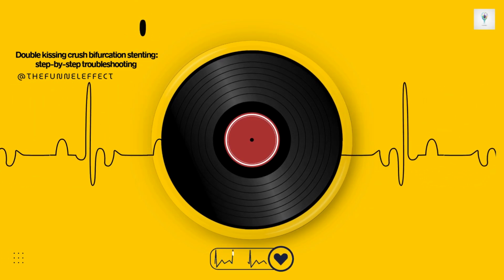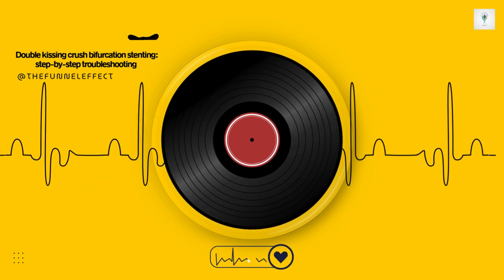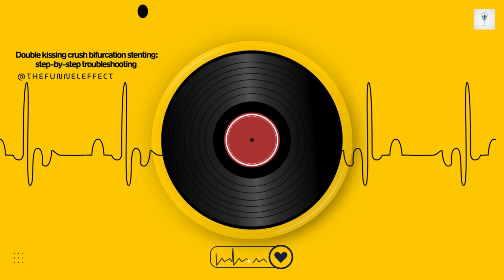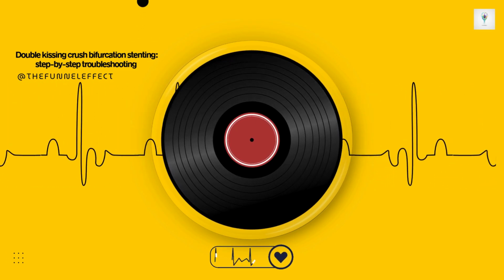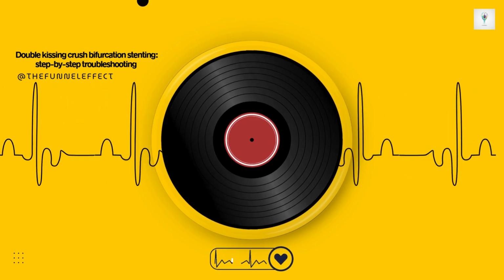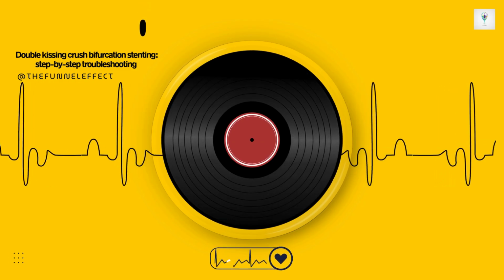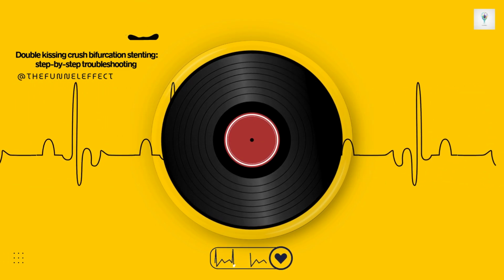If the stent just won't go, do you consider drilling then? You think about it very carefully. If it's a large side branch, heavily calcified, maybe in the left main, and the angle isn't too sharp, then yes, atherectomy might be necessary up front or even as a bailout. But you generally want to avoid drilling in small branches or ones that take off at a very sharp angle. The risk of causing a tear or perforation is just too high. So usually it's balloons first, then support techniques, and atherectomy is reserved for specific, challenging situations.